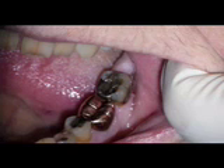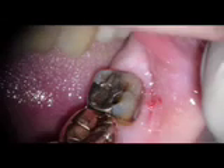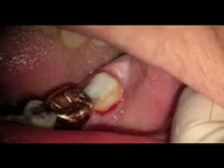In this video you're going to see a full gold crown prep on the lower second molar. At high magnification here you can see the tooth. We're going to use a Picasso light after we prepped the tooth. You can see a crack. We did a core buildup on this tooth, and after the rubber dam was removed you can see some bleeding that was noticeable in the buccal.